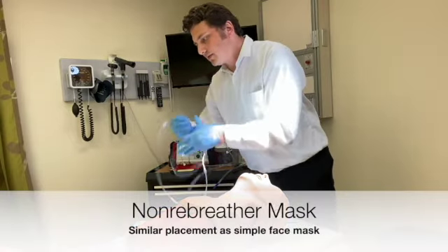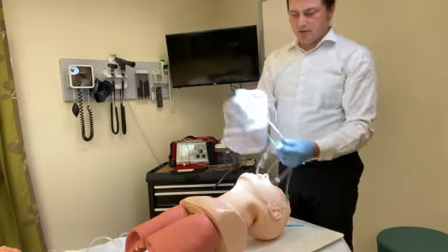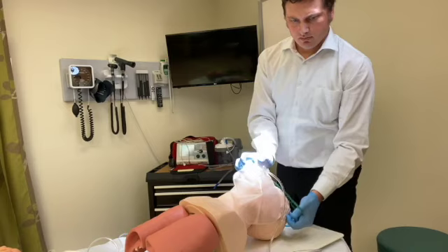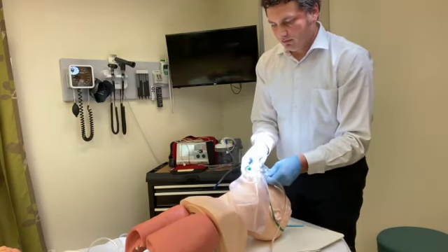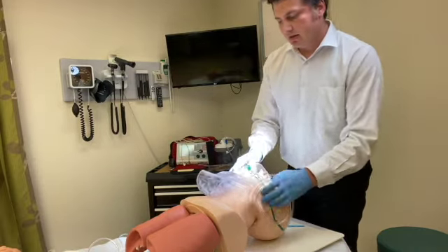Non-rebreather mask is also identified right here, which you'll just put around their face like so, and then up to oxygen. And the reservoir will fill with oxygen.